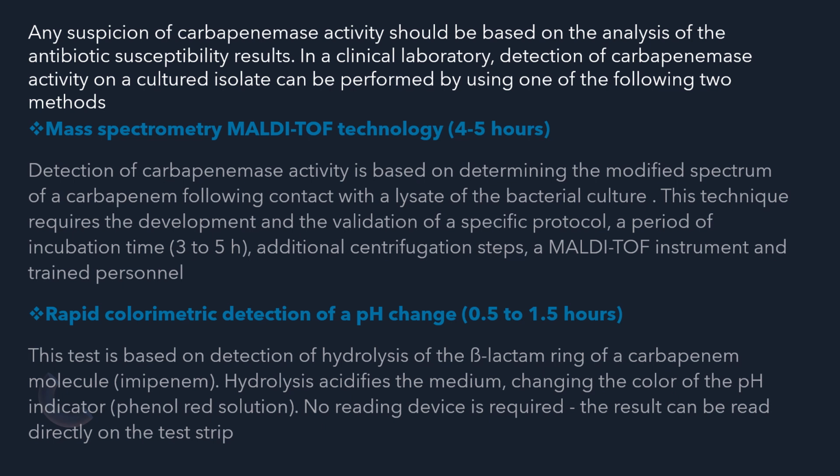This technique requires the development and validation of specific protocol, a period of incubation time of about 3 to 5 hours, additional centrifugation steps, a MALDI-TOF instrument, and a trained personnel.